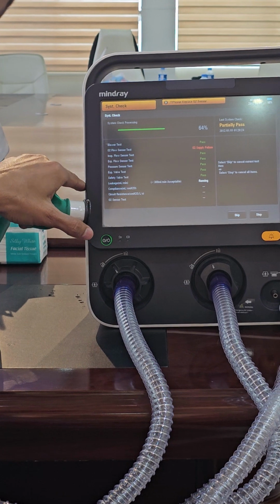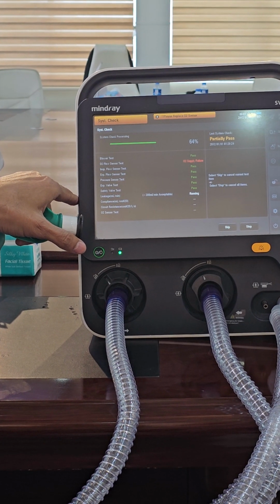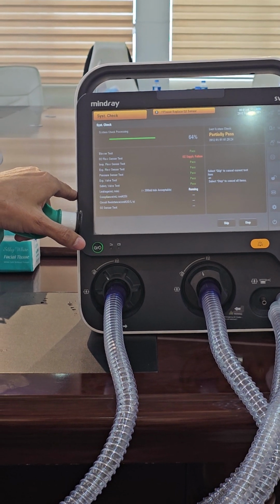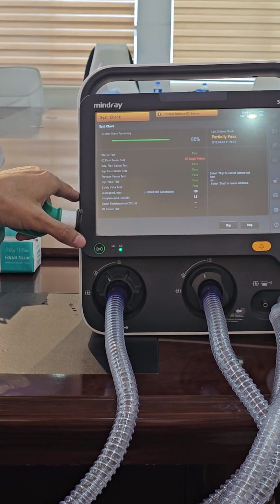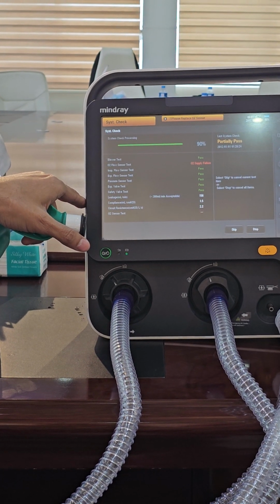It is very important to test the ventilator and be ready, and then put it on. The nurse checks the ventilator every shift and signs. We have the ventilator signature, so they sign that it's ready, and we'll teach them how to do that.